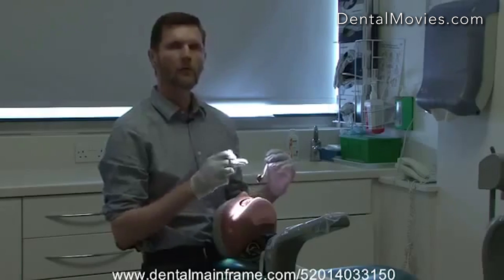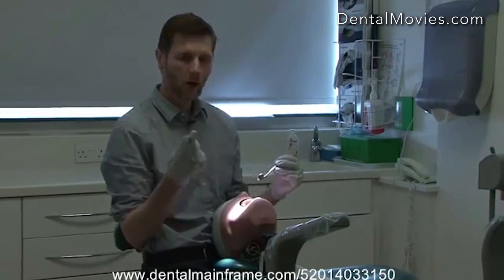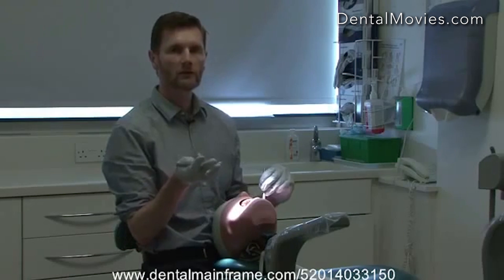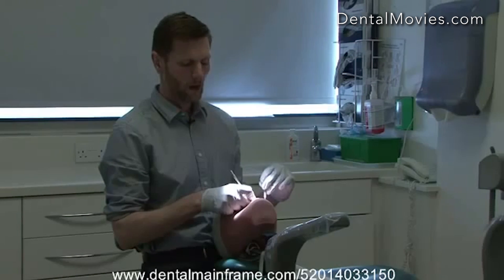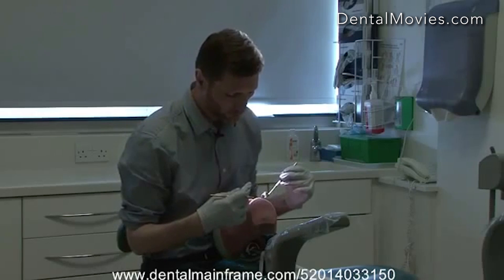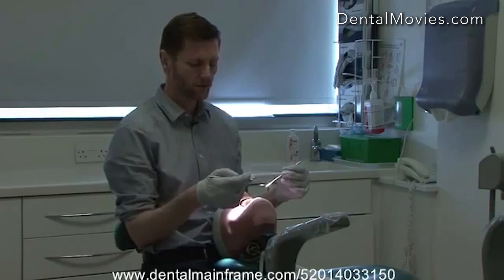At the same time, in operative dentistry we want to be using good finger rests. If we're just using a probe around the mouth then we can use a finger rest at the front to support what we're doing. However, if we're using a drill we'd want to use a finger rest adjacent to the tooth, either on the buccal or palatal surface. The closer the finger rest is to the tooth we're working on, the more skillful we'll be. The tendency though is to always want to lean forward to get a better look, and this is something you consciously have to prevent yourself from doing.